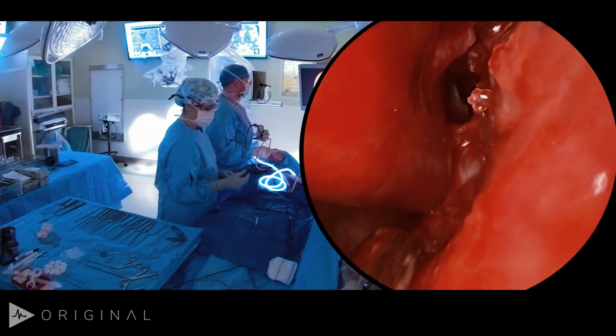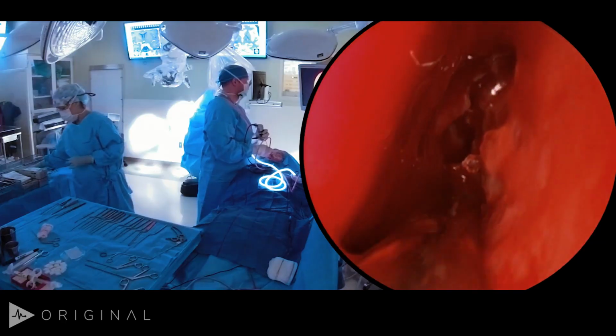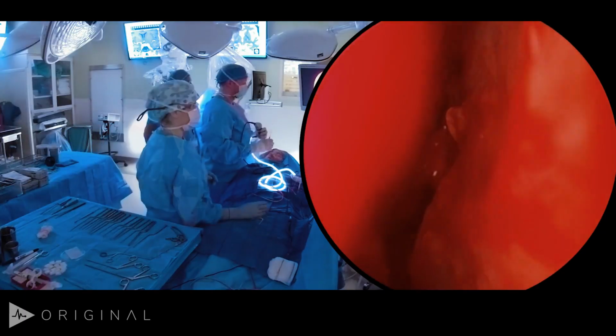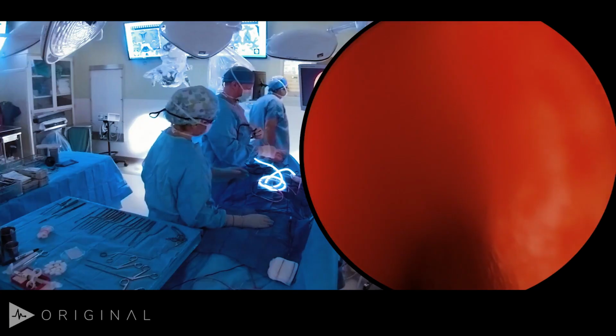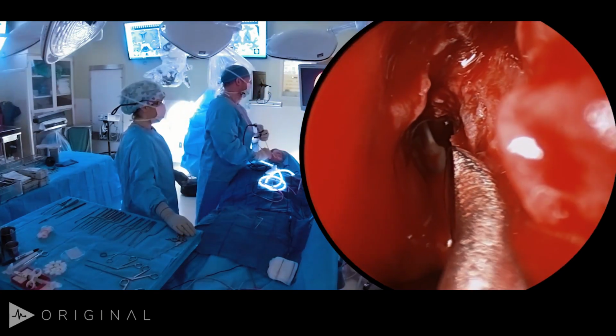So again, this is a very small nasal septal flap. It's mainly just dropping it down so we can get access to the posterior septum back here. Okay, I'm pulling the pledgets out of the other side of the nose right now. That's just going to allow me to fracture over the septum without getting any resistance.